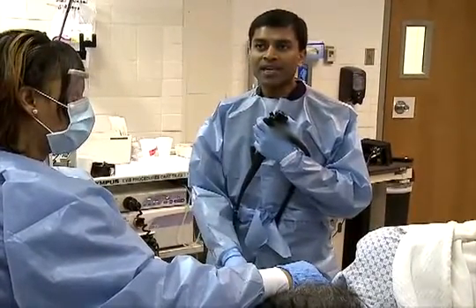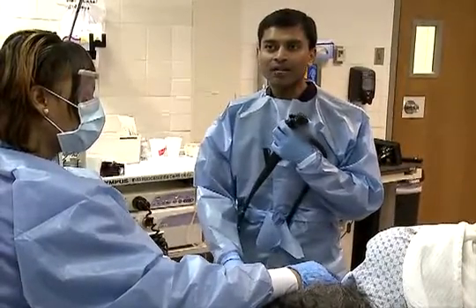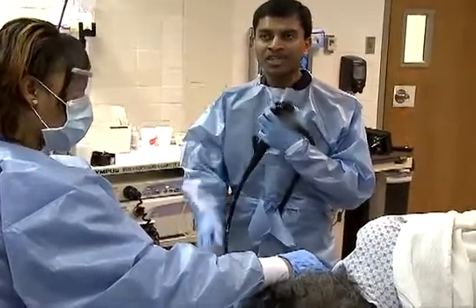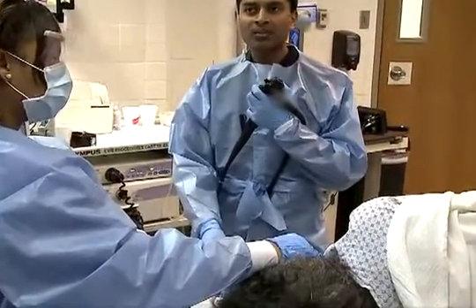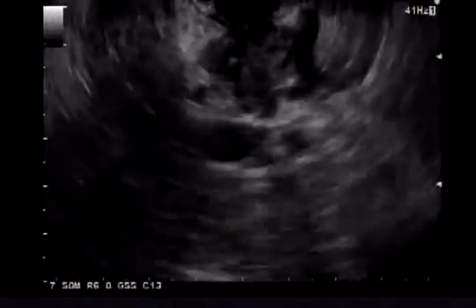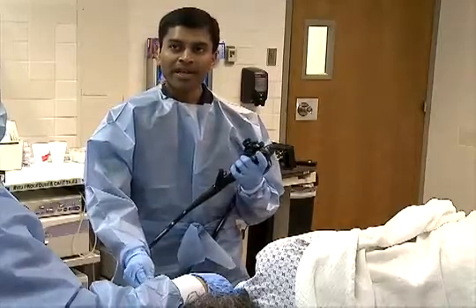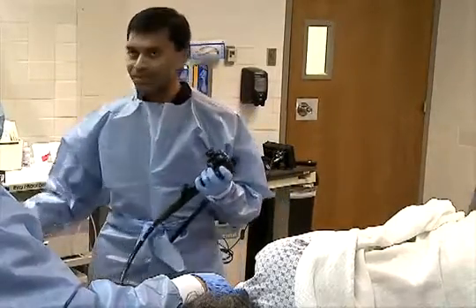So for any transgastric FNAs, I usually prefer the 22 gauge needle because the needle will exit straight out of the echo endoscope, and scope torquing is not an issue. So we will perform FNA on this lesion, and we have access to on-site cytopathology to procure tissue and make an on-site evaluation.